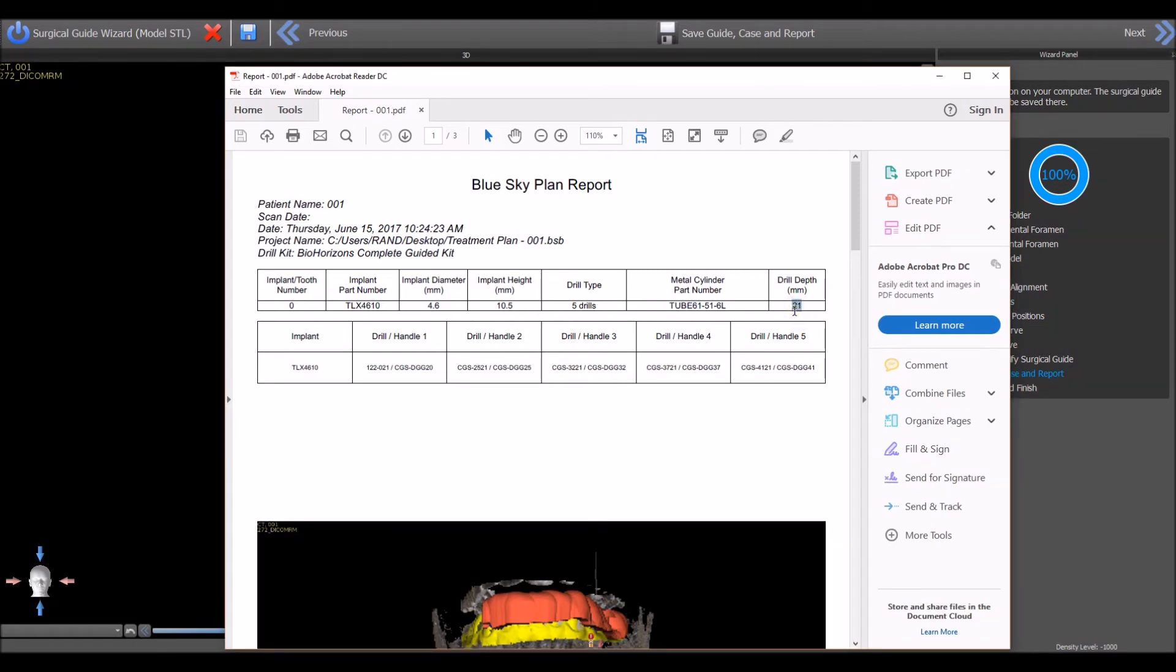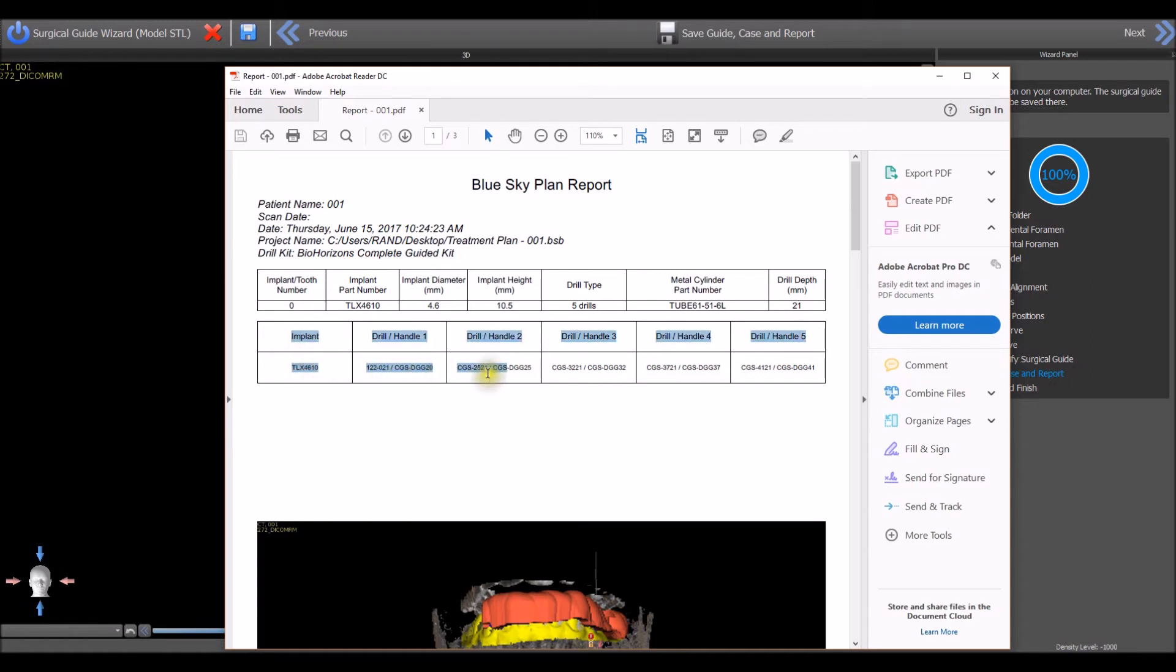The drill depth and the drill and handle sequence based on the guided surgical kit that was selected will also be indicated and appear in the reports.